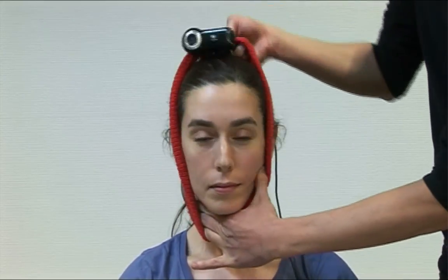With these tools, you can measure your patient's joint position sense. Get a sheet of paper with two red dots on it and stick it on your wall. Place the webcam on the patient's head using the headband.